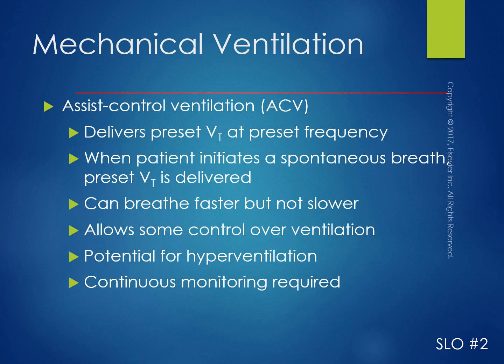They can take maybe 3 extra breaths to equal a rate of 15. The thing is, though, each time they go to initiate a breath on their own, the ventilator will sense that and it will deliver the full tidal volume. That's the preset. So every additional breath that they take is fully supported.